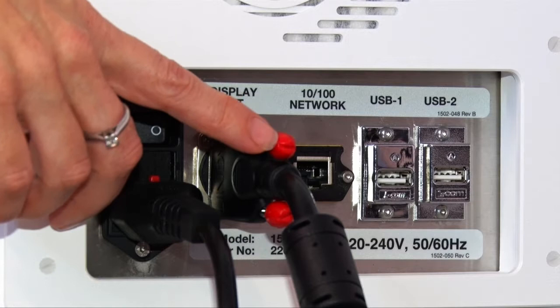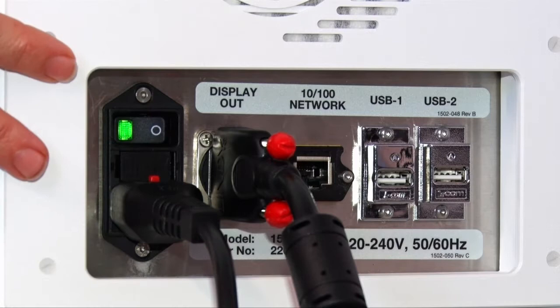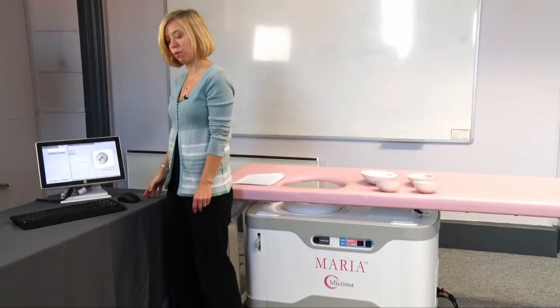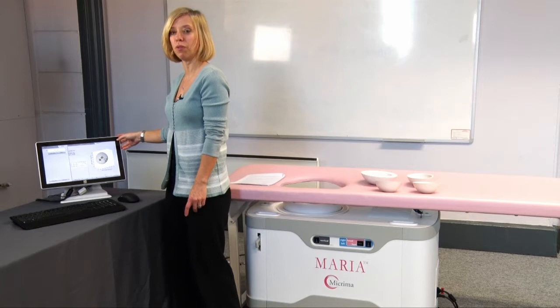On the scanning and processing unit is the power cable and external connector to the display unit. The power button is here above the power connection. This is the operator display system comprising of keyboard, mouse, and screen, which will be used to show all the Maria software.